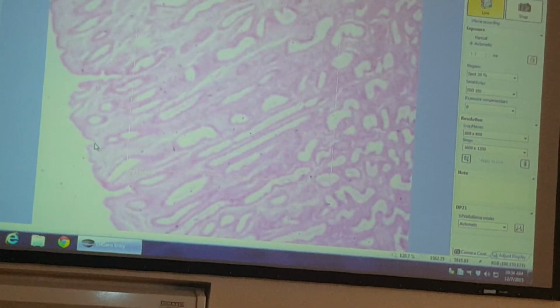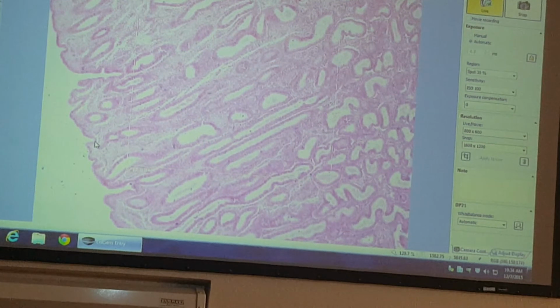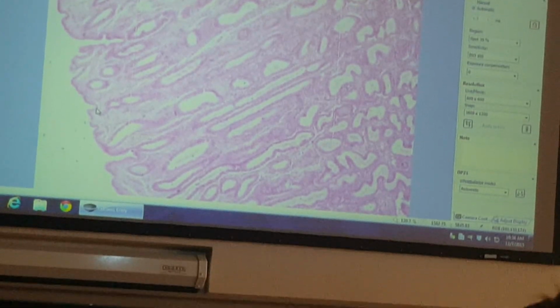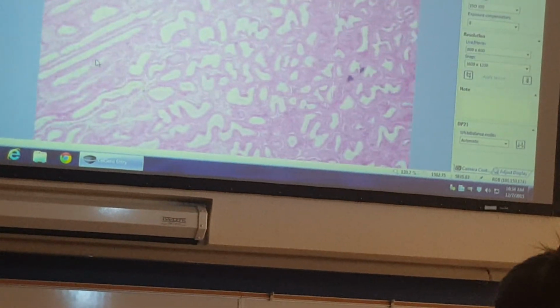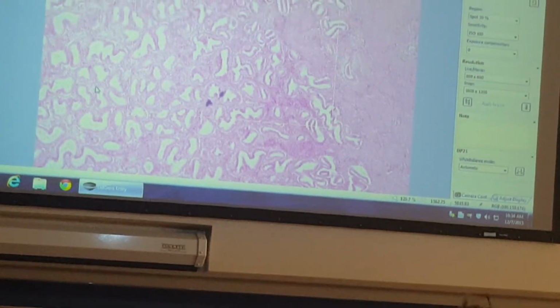Okay, so I did not change powers. I did not change the magnification power on here, and I can't fit the endometrium in the field of view. The endometrium has thickened. Glands have gotten taller and puffier and thicker. If I go a little further, I'm still in the endometrium, and it finally ends right there. So a much thicker endometrial layer.